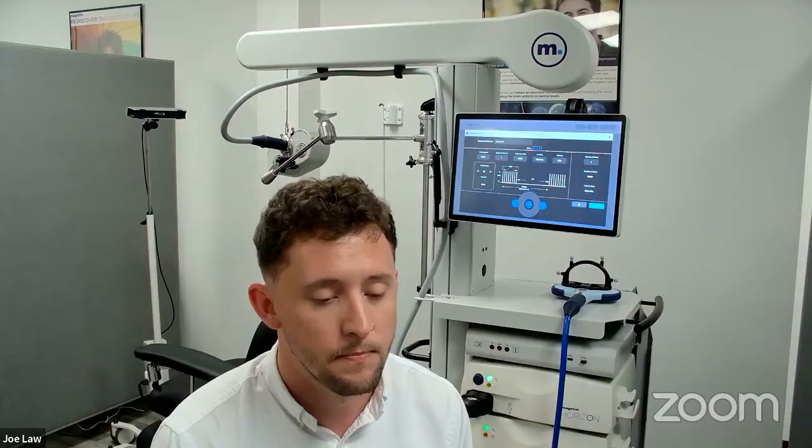Another question: are we allowed to have a procedure to check or verify the current output from the coil? Say that again, sorry. So, are we allowed to have a procedure to check or verify the current output from the coil? I believe what they're referring to is, is the coil output regulated? And I think I know the answer to that.